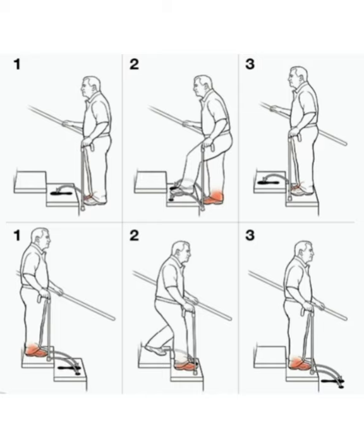When going down, the cane goes first, followed by your weaker leg, then the opposite leg. An easy tip to remember is: up with the good, down with the bad.